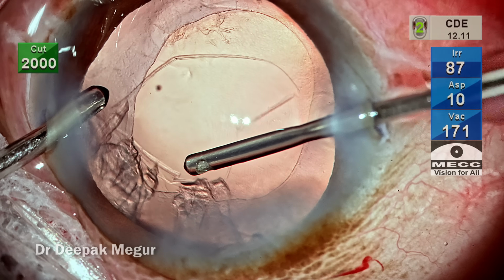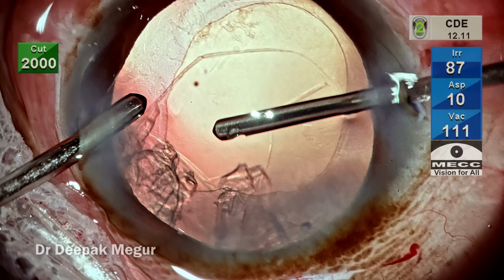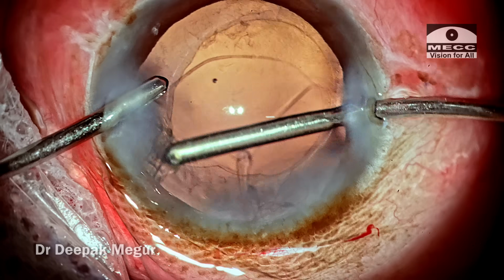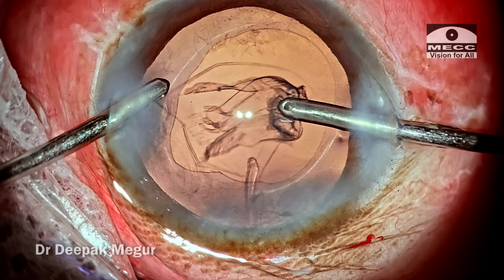Again, in such cases, I think you need to be mentally prepared for a long haul. So it would take multiple entries to deal with one vitreous fibril, but it is worthwhile. Now, once the vitreous is cleared off, the remaining cortex is aspirated.